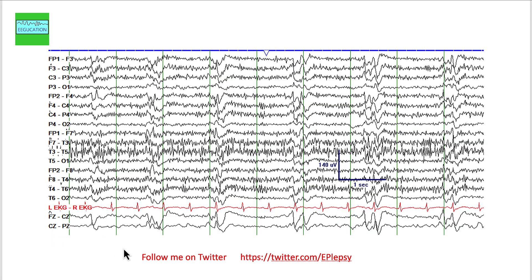Remember to clean up the EEG as much as possible, but be aware that sometimes using filters can make a normal slow wave appear sharp in morphology. You must be comfortable with different types of filters before calling anything abnormal.